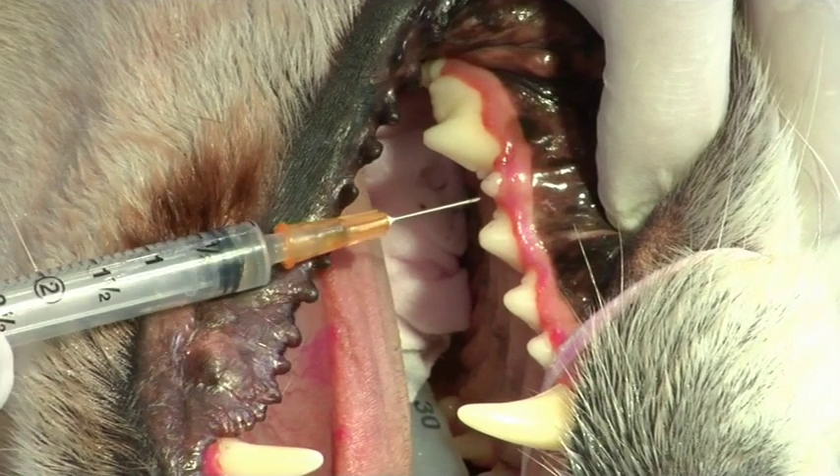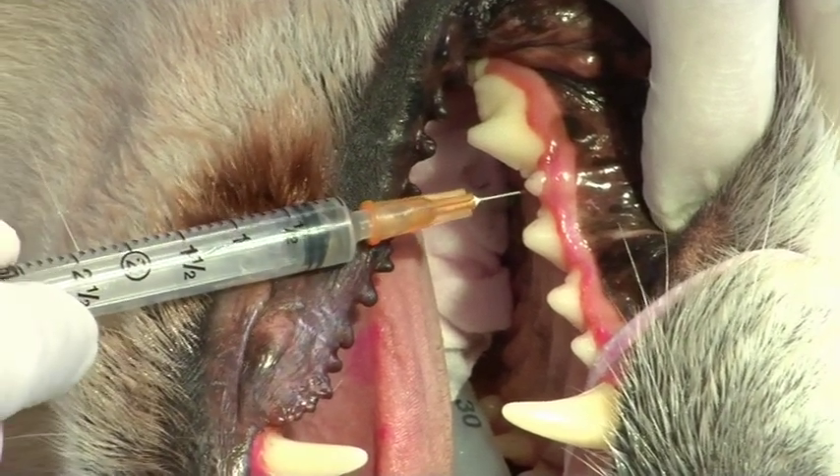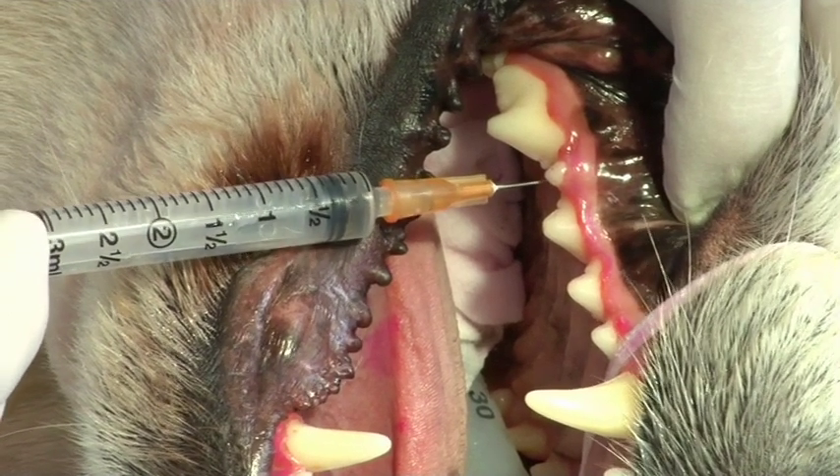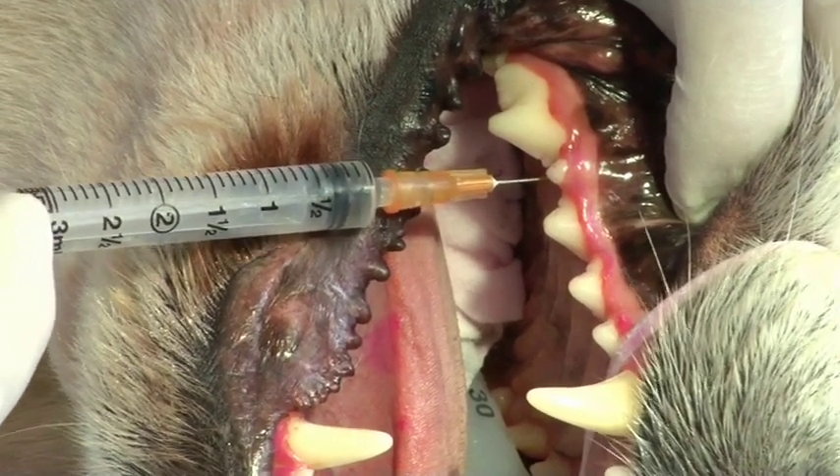We will also give a palatal infiltration around the tooth to be extracted, and this will give anesthesia to the mucosa around that tooth.